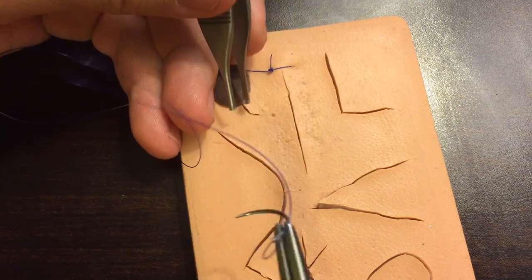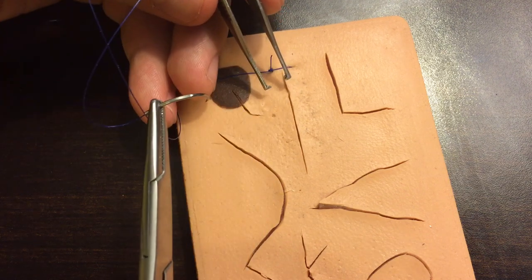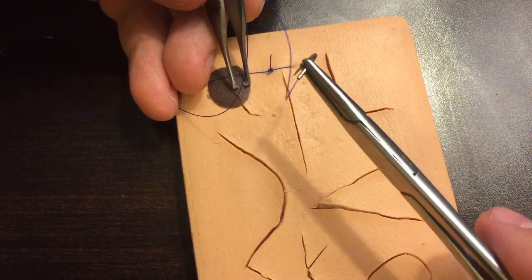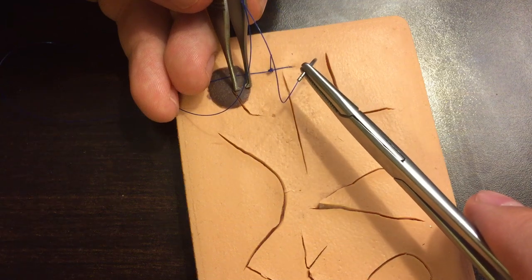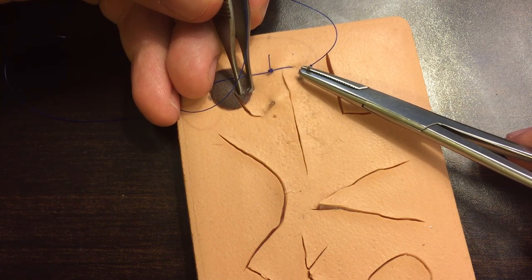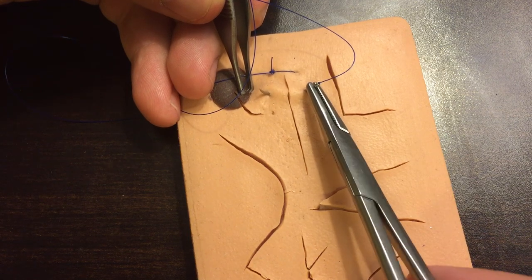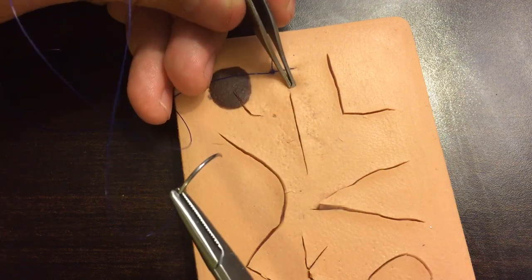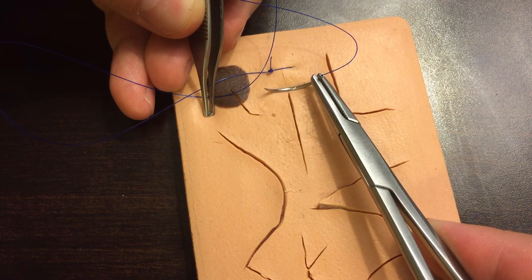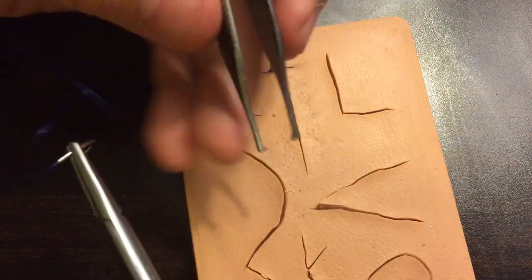So then your next move is to do another throw, another pass through the patient's skin. But you're going to be doing it very similarly to a simple interrupted, just the exact same as what you just did. Now, lots of mistakes are made when people are making a continuous suture and they'll place the part that goes through the patient's skin at an angle rather than perpendicular. But you see, when you tighten up the suture in this case, it's going to try to tighten like this, and then it's going to bunch up the skin. It's not going to heal well at all. So a very key point to a continuous or a running suture is you need to make sure that the part of the suture that's passing through the patient's body is perpendicular to the laceration so that it pulls straight across. Any part of your continuous suture that is diagonal needs to be the part that's outside of the skin.